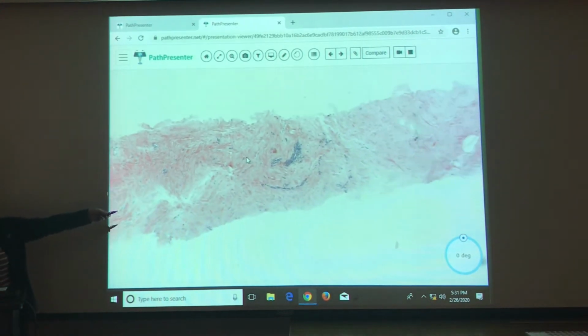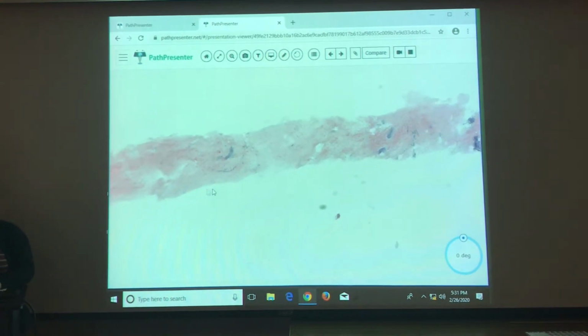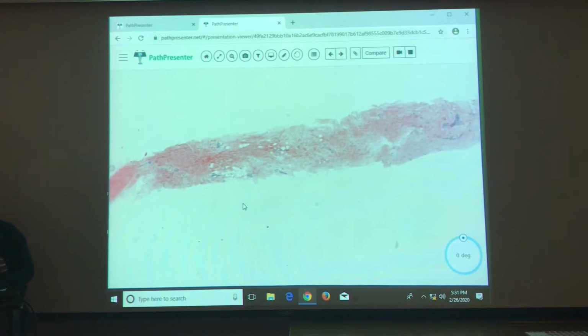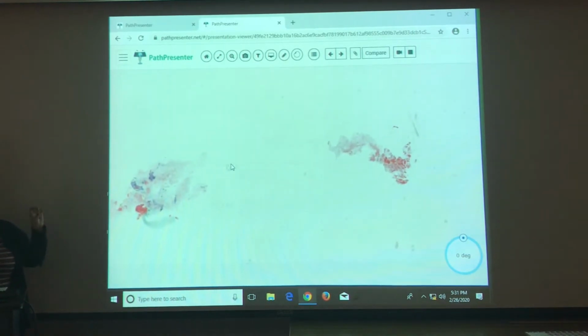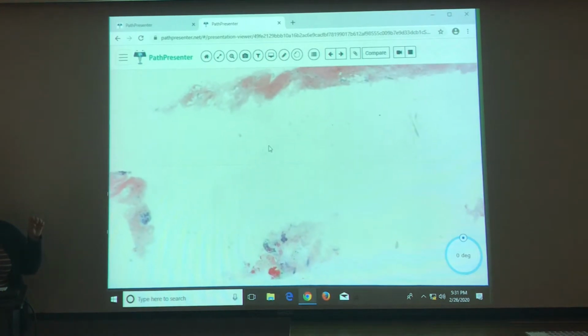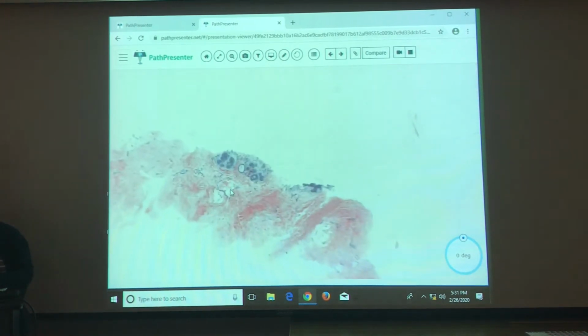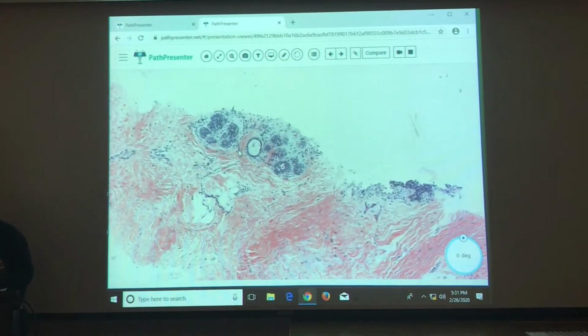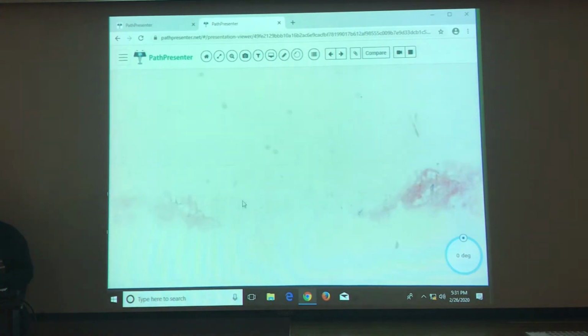Could this be normal breast? It could be. This was kind of the only example they had that was more normal, but there are small areas with an increased lymphocytic focus. So you could argue, is this patient maybe a diabetic or maybe has some resolving mastitis? But it's so mild. This is pretty much what normal breast should look like.